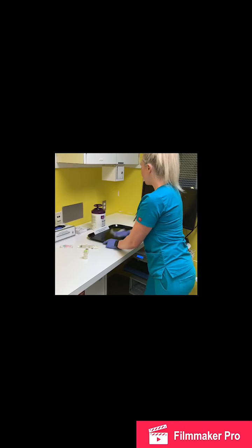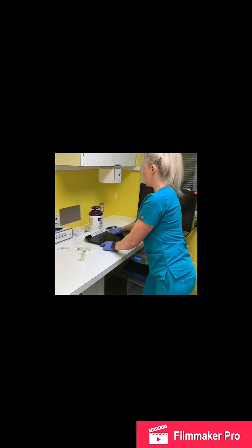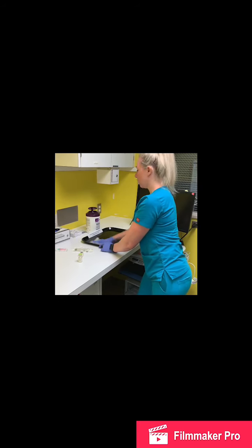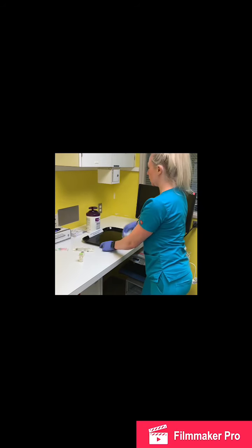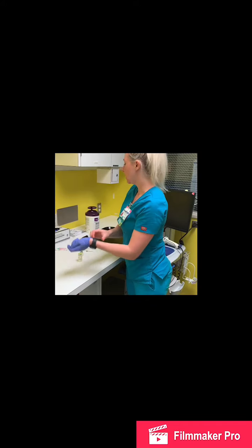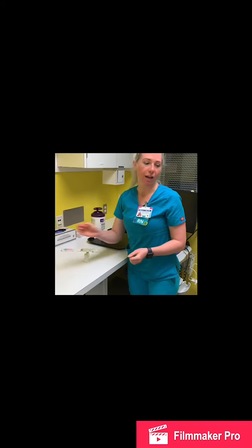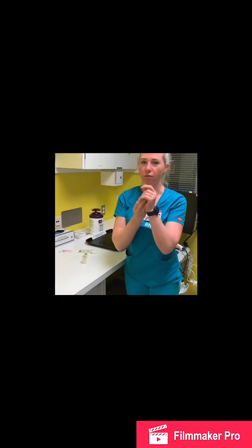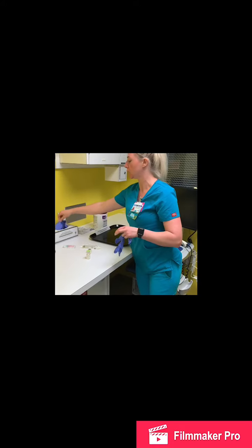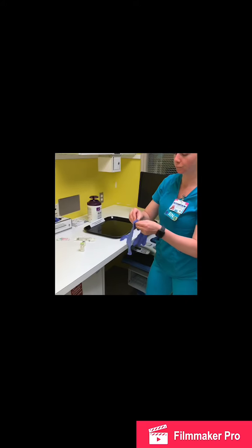So you'll wipe down the area, having that wet contact time of 2 minutes. And then we of course need to let the area fully dry before we start reconstituting. I'm then going to change my gloves, and I would perform hand hygiene right now prior to donning new gloves and preparing to reconstitute my medication.